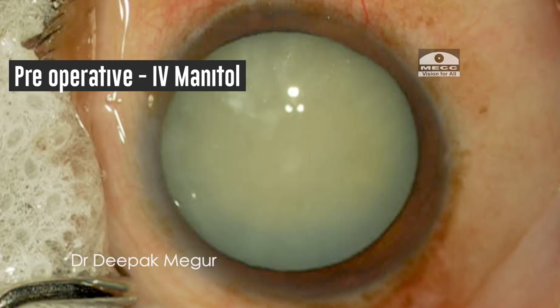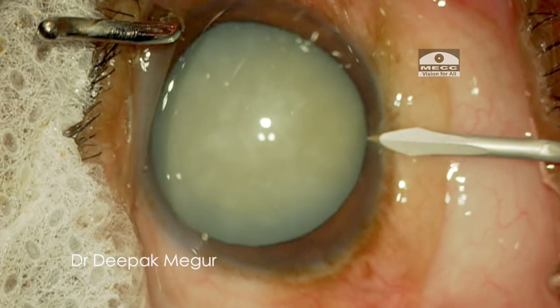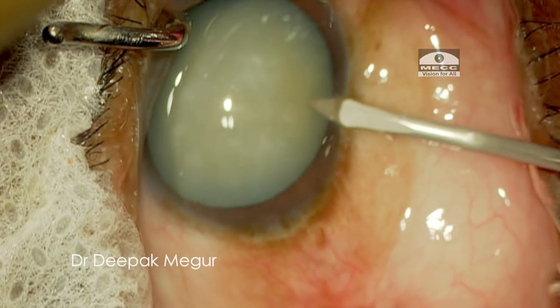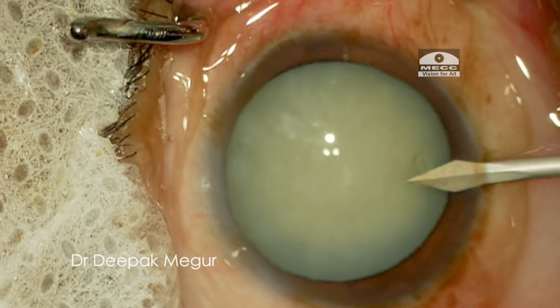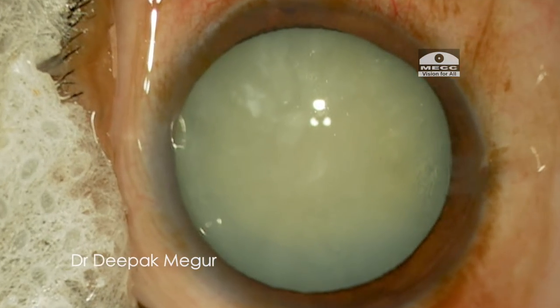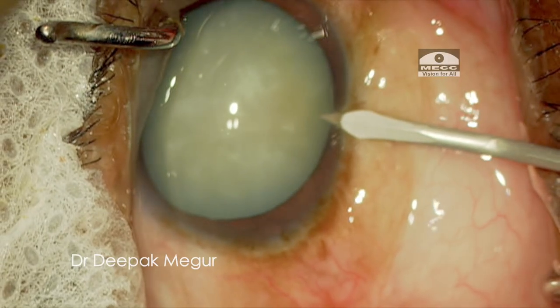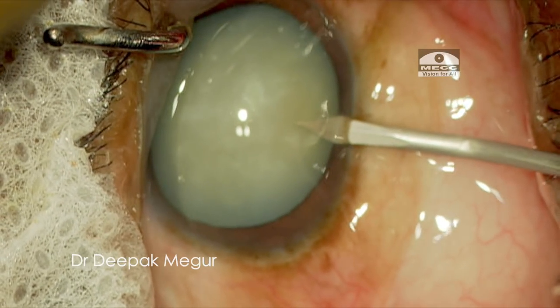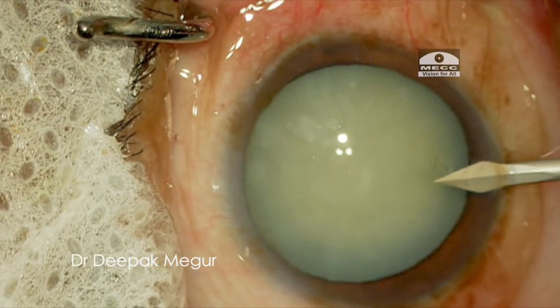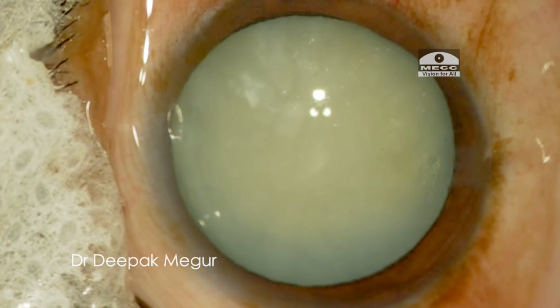I am doing the case and I make my first side-port. At this point I notice something unusual. At first glance I suspect the tense anterior capsule has been nicked by the side-port. In the replay we can see that the blade looks like it has touched the anterior capsule. This happened in spite of using an MVR blade, which does not traverse much into the anterior chamber.